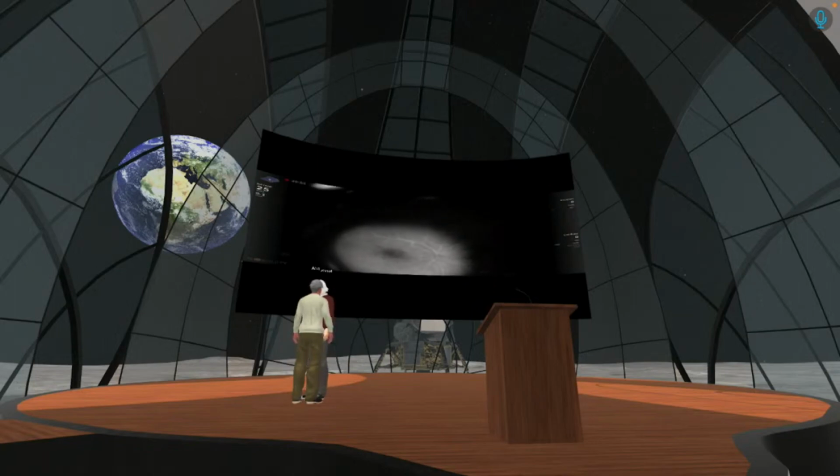Yeah. So this is achieved with Constellation light source and digital filtering from the Ingenuity. Again, I emphasize that no barrier filter was needed to achieve this image in my settings. So this is the image here.